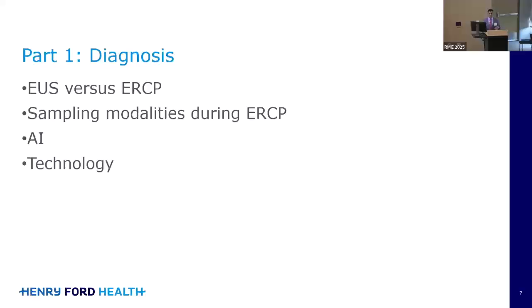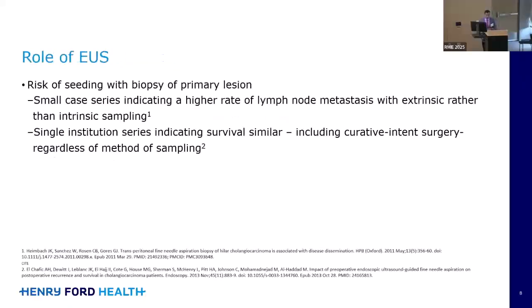So I put this as a two-part talk, although with the time, I don't think we're going to get to part two, which is how to drain a hilar stricture. So we'll focus on diagnosis. And the things that I wanted to talk through are EUS and ERCP, how they're complementary, sampling modalities that are available during ERCP, and then a broad overview of what's coming, AI and newer technologies.